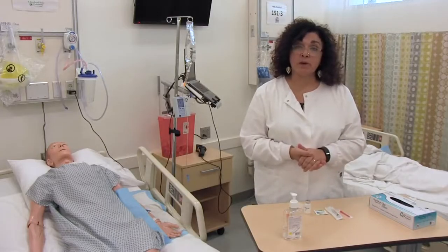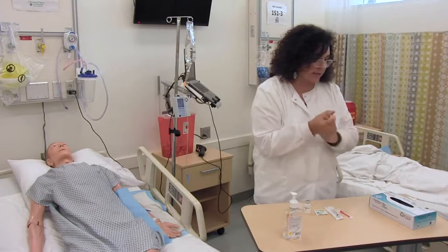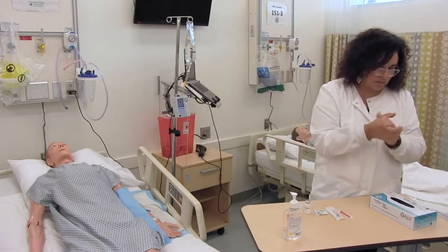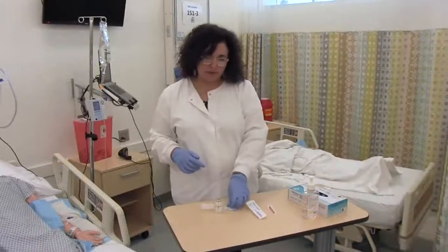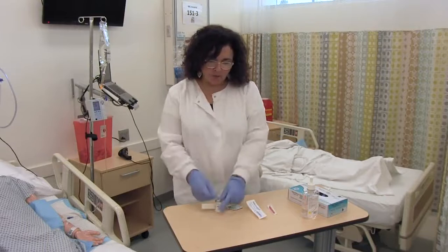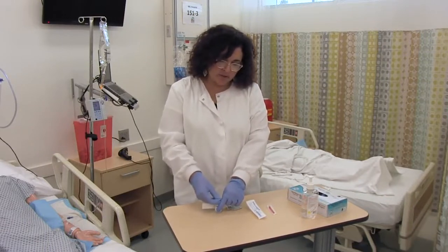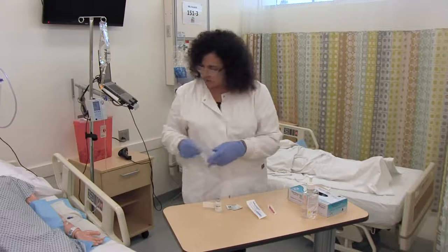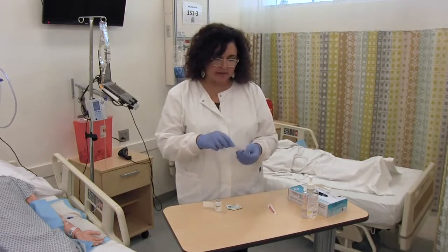So now I'm ready to prepare the medication, so I'm going to wash my hands and put on some gloves. Okay, so I'm going to begin by scrubbing the top of my vial for 15 seconds. So I am going to use a good bit of friction. Make sure I scrub that down. And while that's drying, I'm going to assemble my needle and syringe.